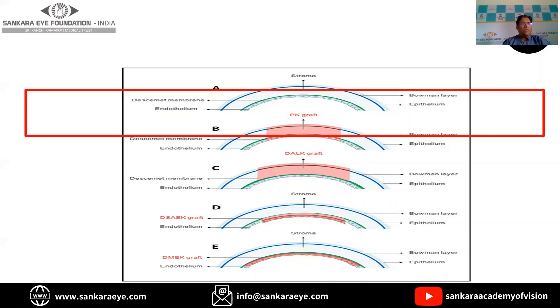In the next eight minutes, I will try to explain the different instruments that are commonly used in penetrating keratoplasty, and we shall also talk a little bit about the surgical procedure.